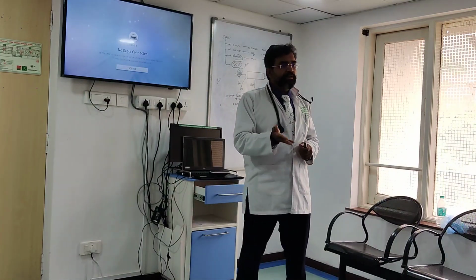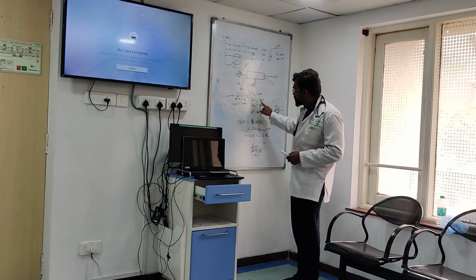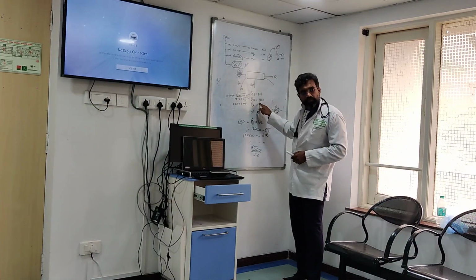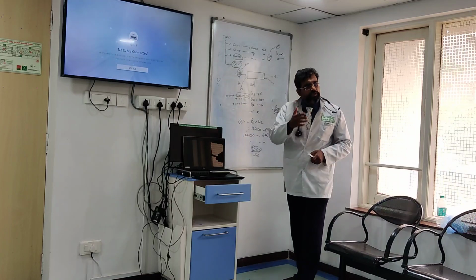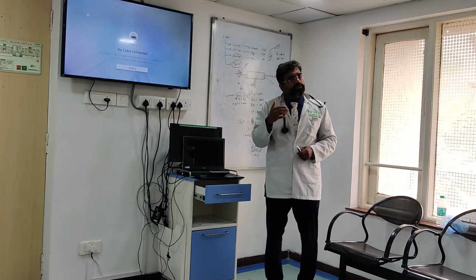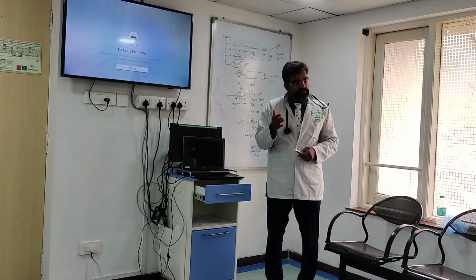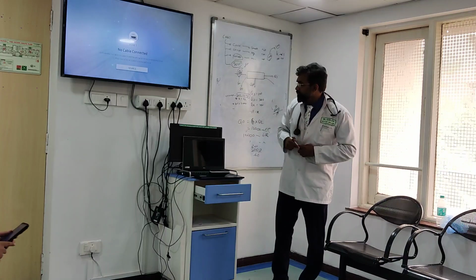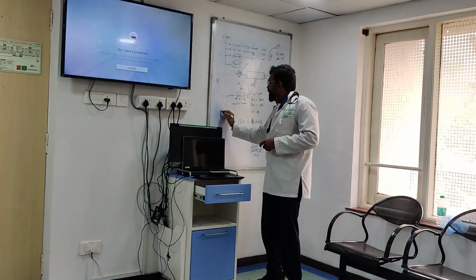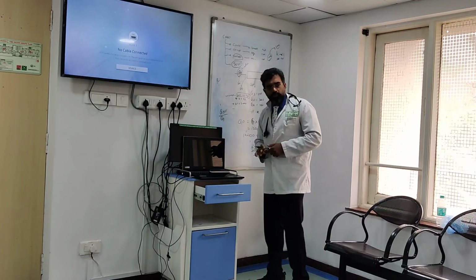I want to increase this as much as possible. अगर मन चाहूंगा तो मैं इसको 6,000 रखूंगा, 6,000 ml per hour, क्योंकि then my diffusion capacity will be maximum. There is no upper limit. But what happens as you go higher and higher? Your filtration fraction will start increasing, which we have discussed. Filtration fraction is actually effluent flow upon blood pump flow.